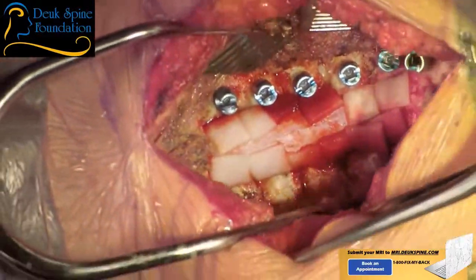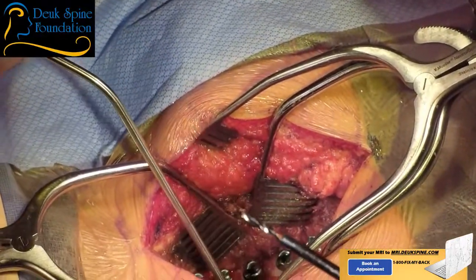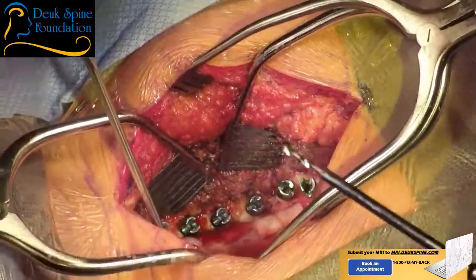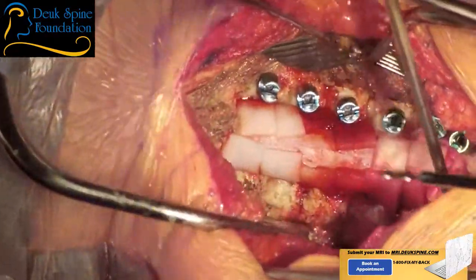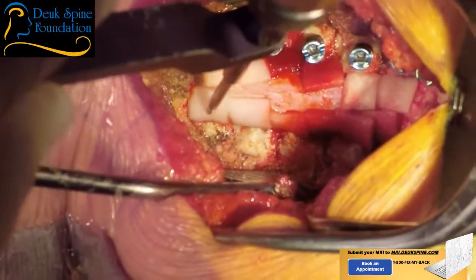Now, for those of you who have been paying attention, you noticed when I drilled the T1 and T2 pedicle screws, I didn't do more than a 14 millimeter drill bit. That's all I got. I never changed it to 16, but I still use a 16 screw. And that's perfectly fine to do.